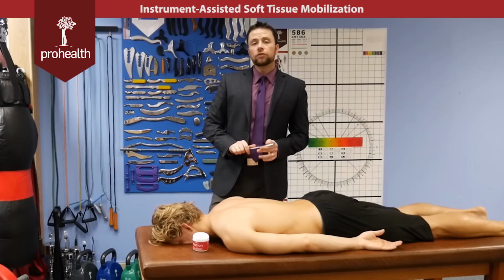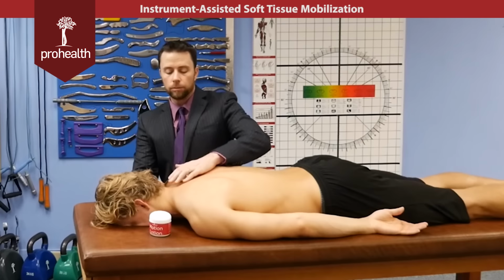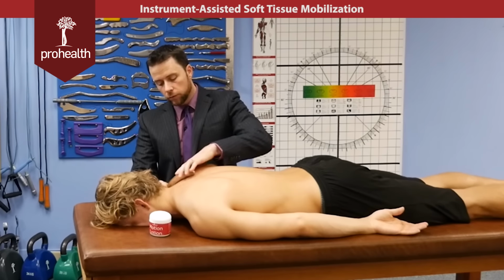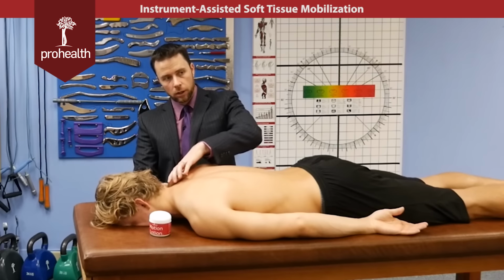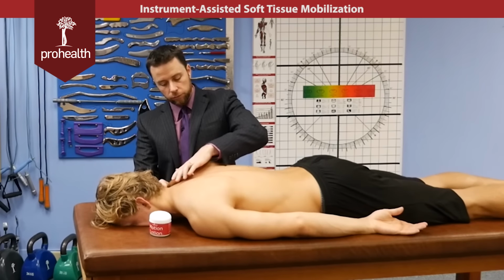So we're going to look at the ProStim 1 tool basic application. Generally, you'll start with a scanning stroke, where you'll just work through and look for any areas of tightness or stiffness, or a little bit of fibrous adhesion maybe, or just roughness in the muscle itself. Okay?